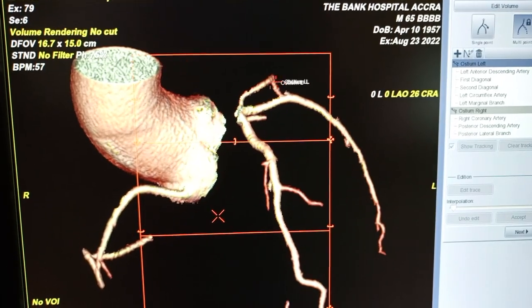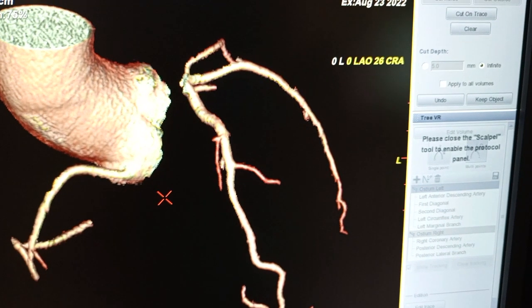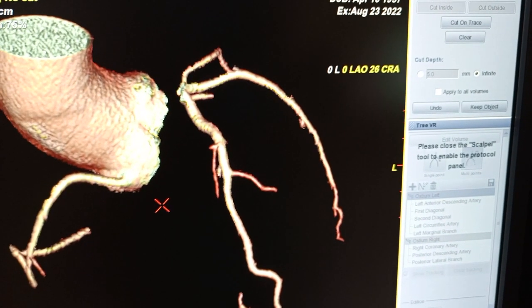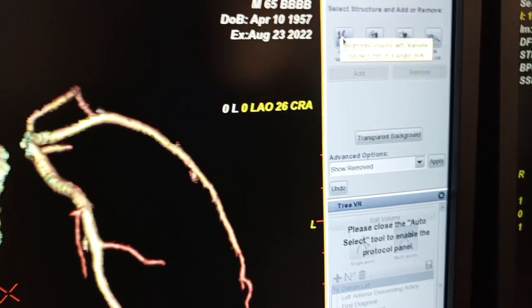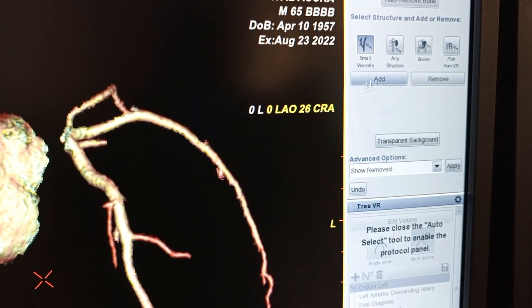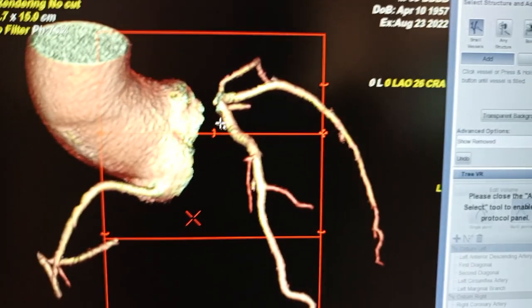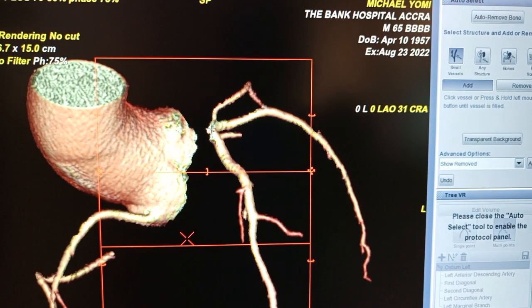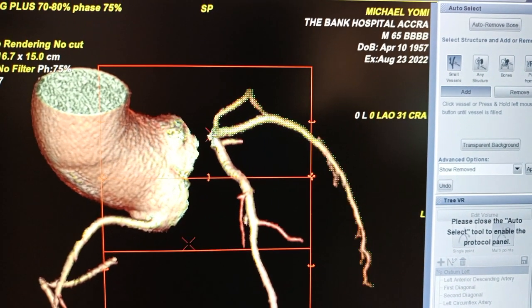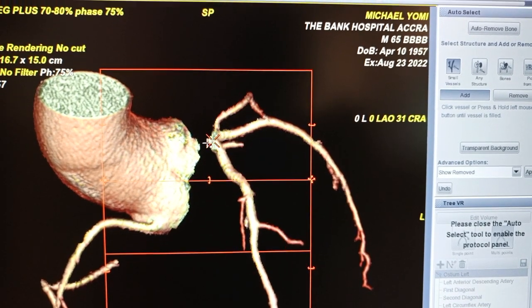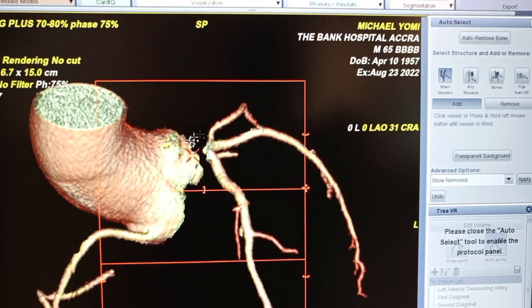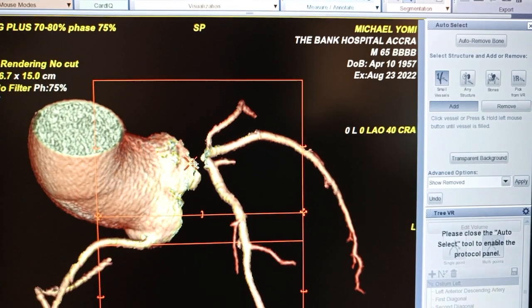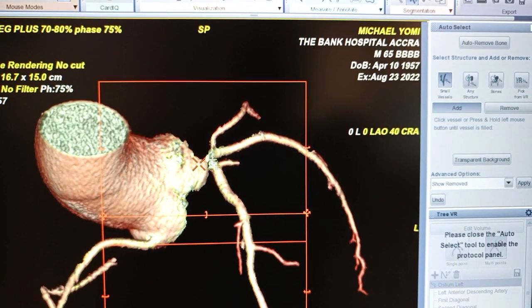What you have to do is grow a vessel. You go to Segment, then choose Auto Select and choose Small Vessel. With the small vessel selected, you click on the area to highlight where the vessel is — you just click and hold to drag it so it will outline all the vessels in the area you want to cover. Left click and hold like that.